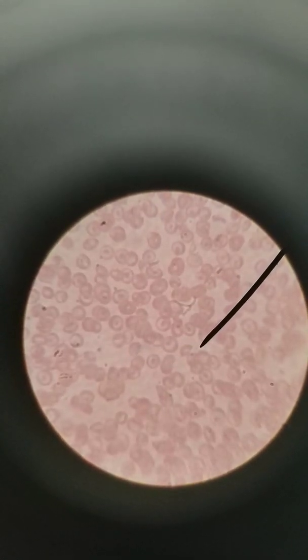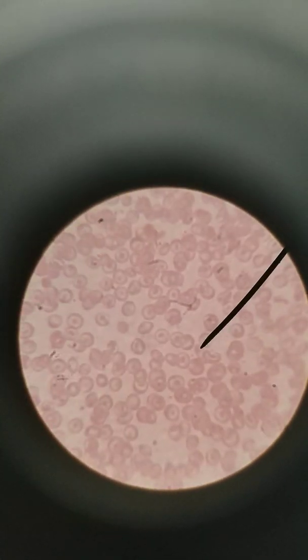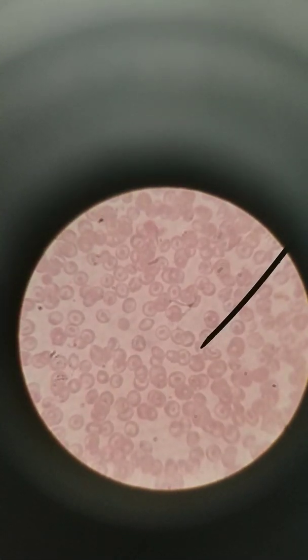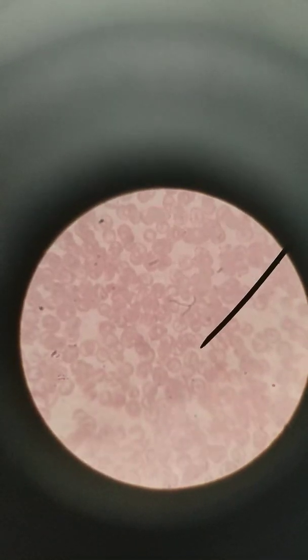This is sickle cell anemia. The cells are sickle shaped. I know it doesn't always look sickle shaped, but the cells are in odd shape. Some look very sickled, some just look odd and misshapen and pointy. If you see pointy cells that aren't dimpled, you're looking at sickle cell anemia.